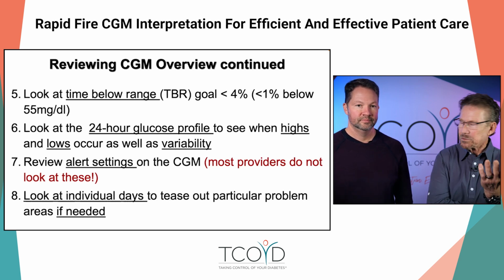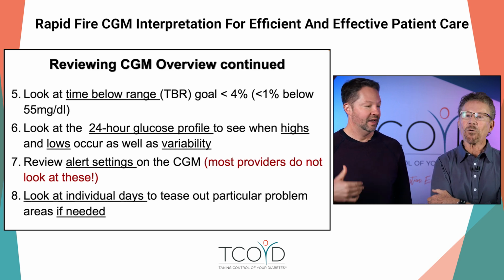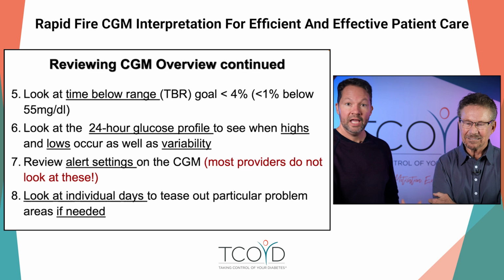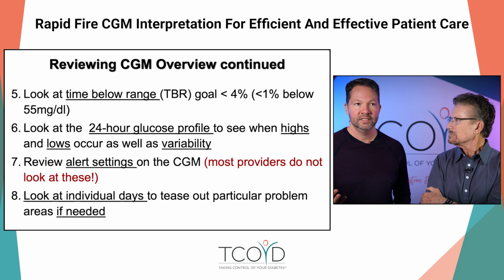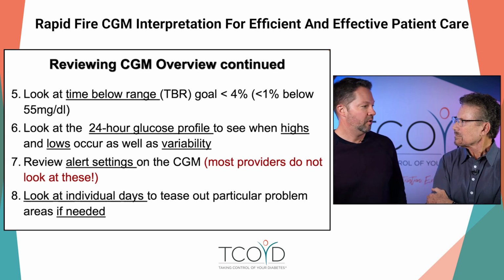And it comes down to if there's time. I'd say a couple things. Some of these downloads will give you the patient's best day. I actually like looking at that with them, especially if it was in recent history. So it's like, hey, yesterday was your best day. What did you do that day? And then it's usually not like a momentous thing. It's kind of like, oh, I just ate a little less carbs, or I went for a walk or something.